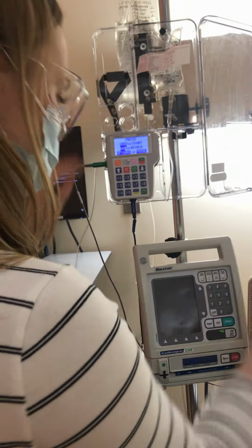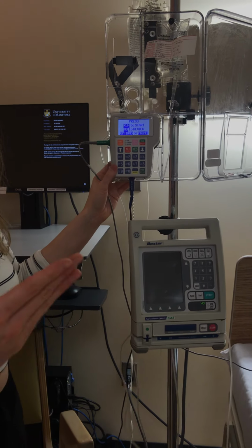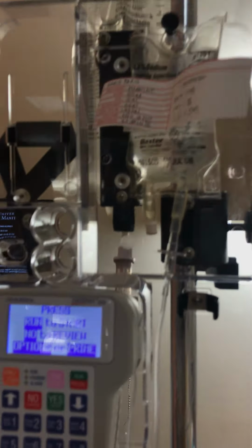So at this point, it's already hooked up to the patient. I haven't pressed start yet. I would get my second nurse to come in, and I would get my second nurse to review all of this to make sure I have set it up correctly. Looks good. The second nurse has agreed that it looks good. So at this point, I can close and lock this, and I can press run to start. It will only infuse if my patient presses the bolus.